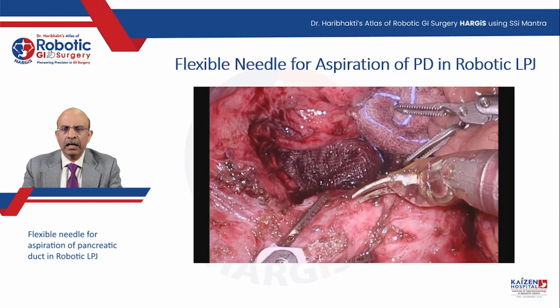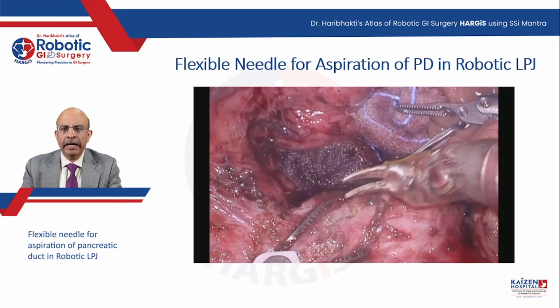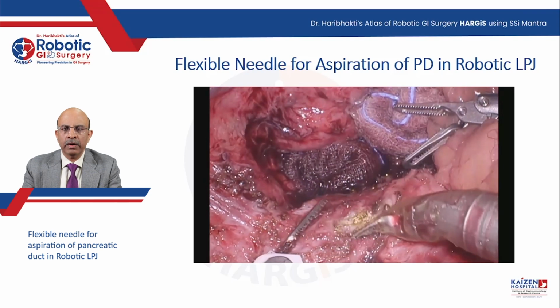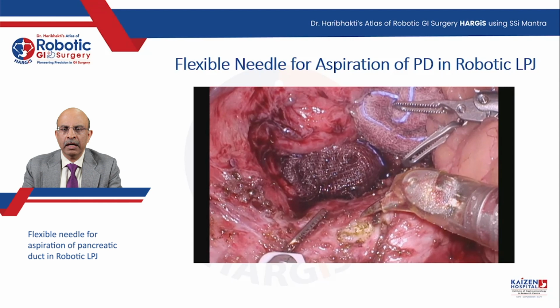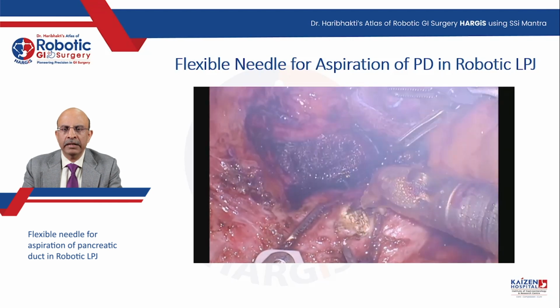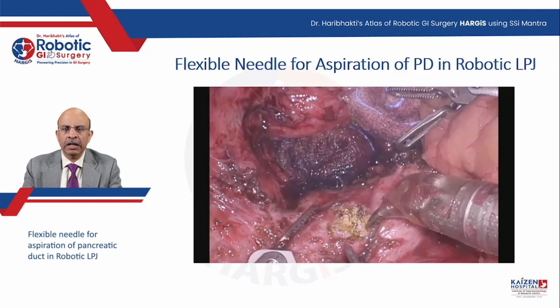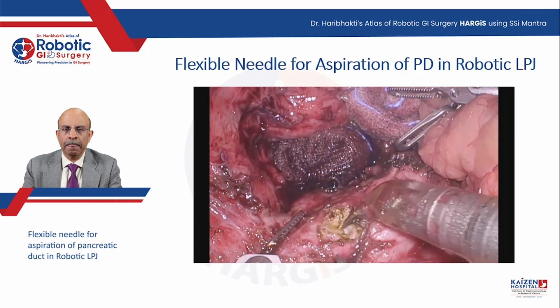After confirming, a scissor incision is placed on the pancreatic duct. If the area is not very clear, then we would prefer to open not longitudinally but vertically on the pancreas, so as to hit the pancreatic duct. The left hand instrument stabilizes the pancreas, and the right hand opens a vertical incision in the pancreas so that we can go deep and try to hit the pancreatic duct. I use a combination of blunt and sharp dissection with forceps and try to get into the duct.